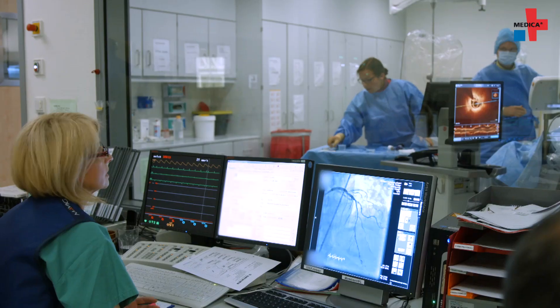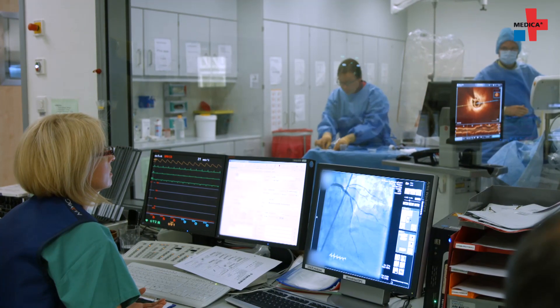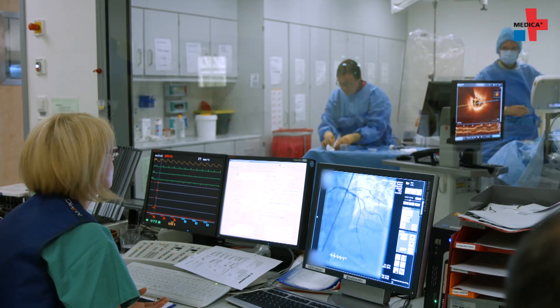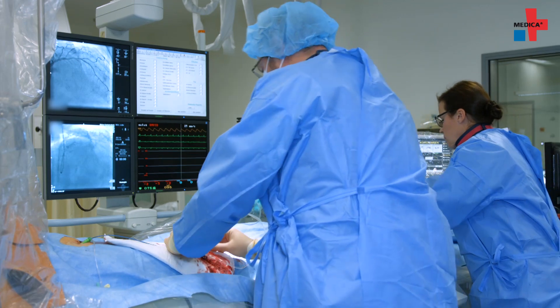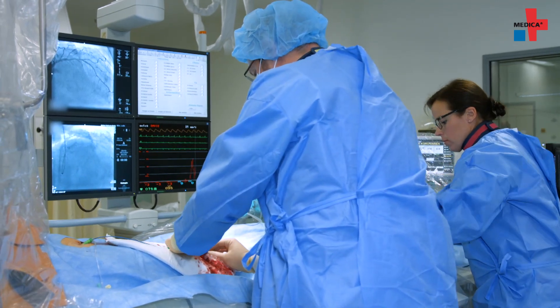We use this technique when we are unsure about the optimal coronary treatment or the success of the stent placement. We then take another look at the stent from the inside and check whether it is still not close enough to the wall, because this might later lead to restenosis or even stent thrombosis. Those have been common in the past. We can also detect cracks on the inner lining behind or in front of the stent and treat them accordingly.